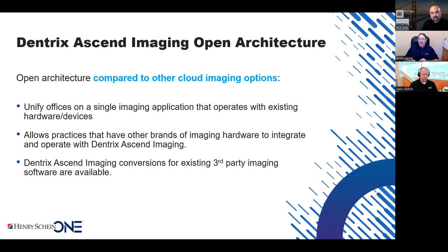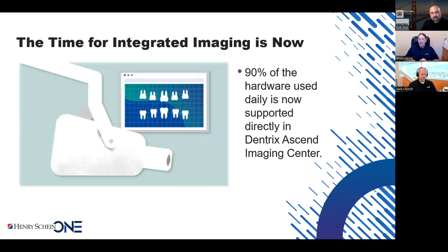But real quickly, Zach, if you want to advance one more slide. Yeah, we wanted to point out that now that the hardware has matured so much, there's no need for third-party software to interpret that hardware. We take that hardware, plug it directly in, and now use it directly in Dentrix Ascend. One more slide, Zach, if you could.